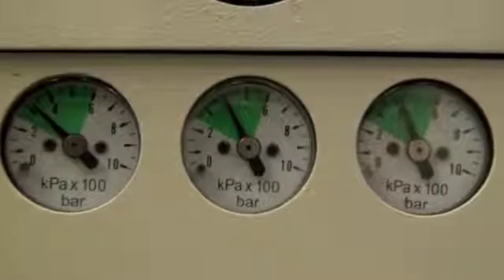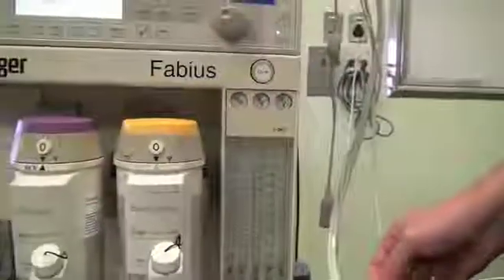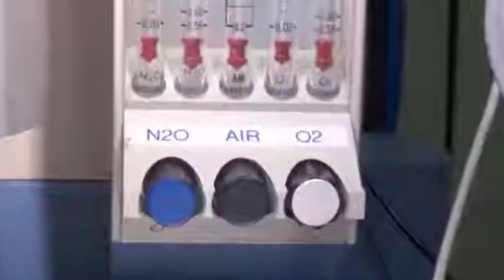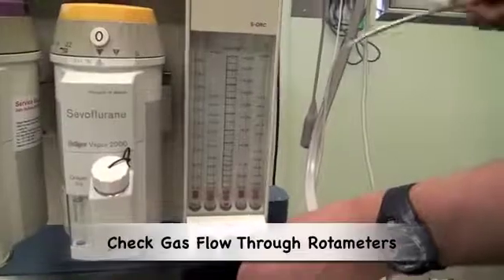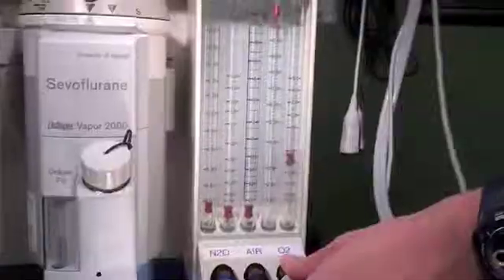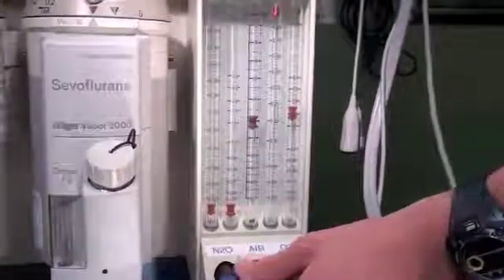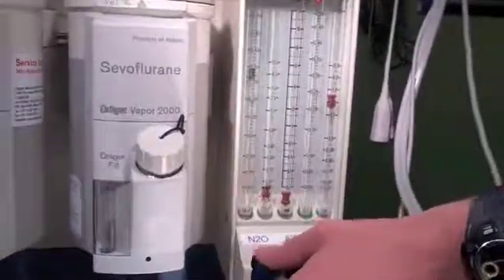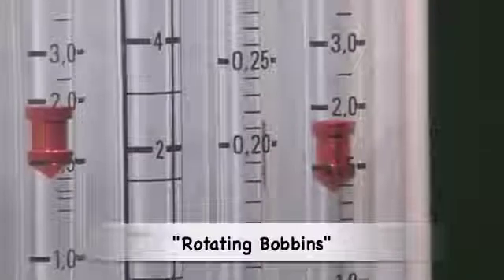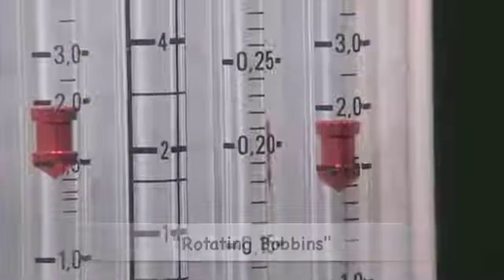These gauges are for each gas — as we can see, they correspond to nitrous oxide, air, and oxygen. One then checks the flow of each gas through the variable orifice rotameter. We check the flow of oxygen, medical air, and nitrous oxide. The bobbins rotate so that one can confirm gas is flowing and that the bobbins are not stuck.